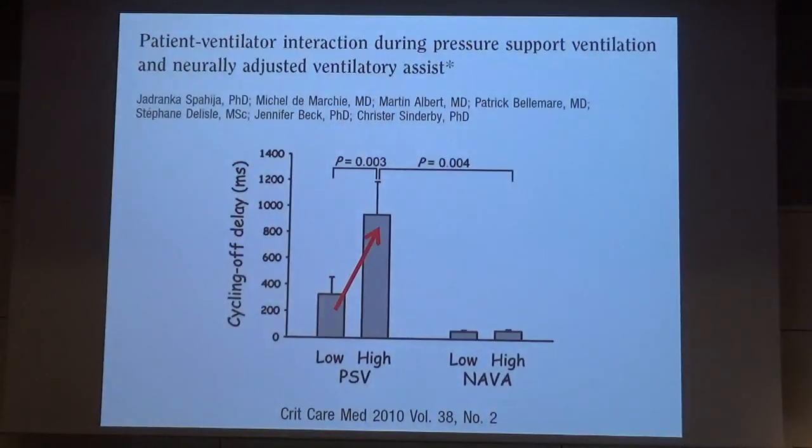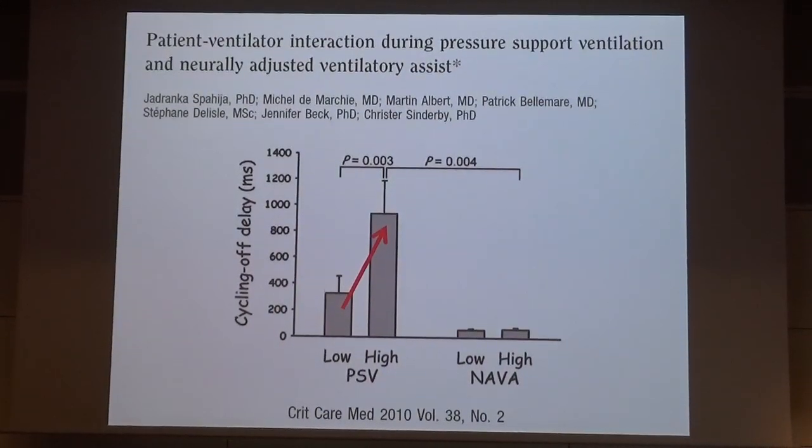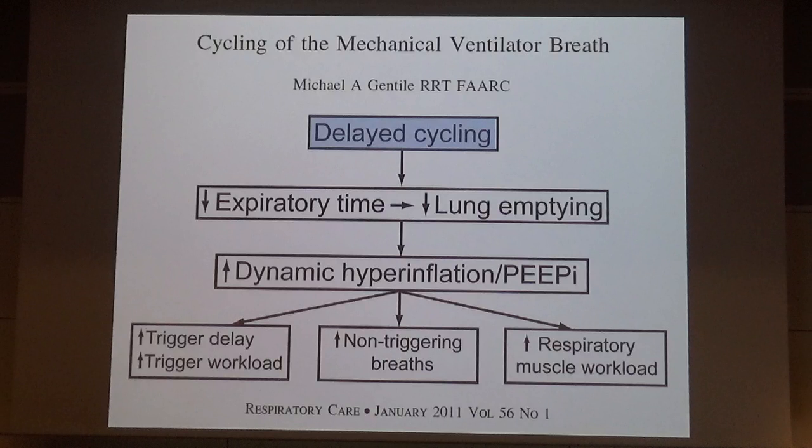This is a well-known problem of pressure support ventilation that is magnified by high pressure support level. It means that the higher the pressure support level, the later the cycling off, and the longer the time the ventilator may be insufflating the patient during neural exhalation, especially in COPD obstructive patients. And this may promote dynamic hyperinflation and auto-PEEP, finally leading to difficult triggering and ineffective efforts.